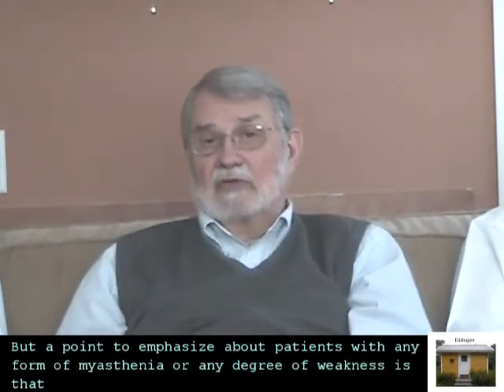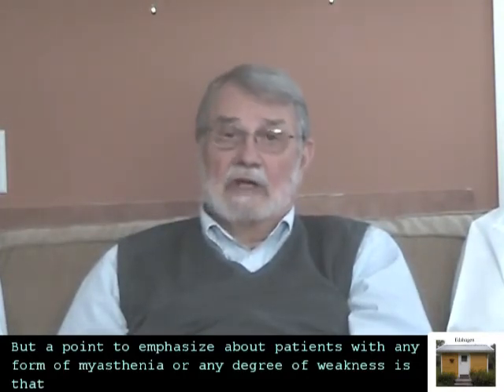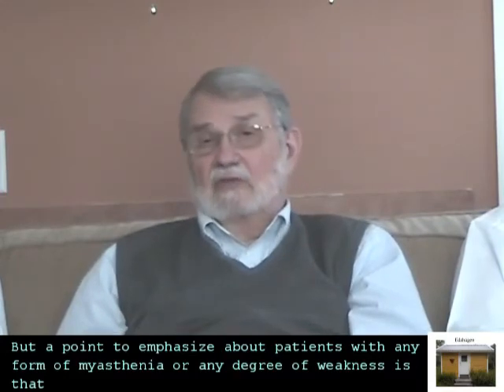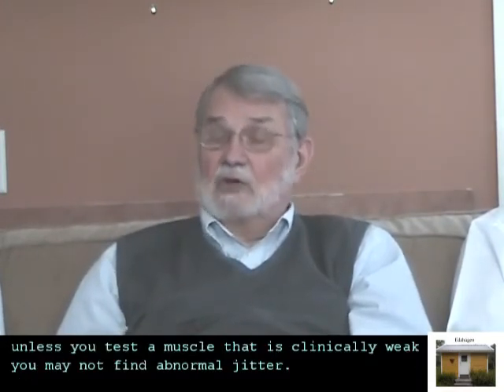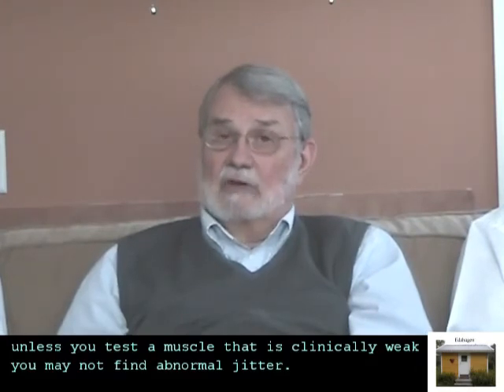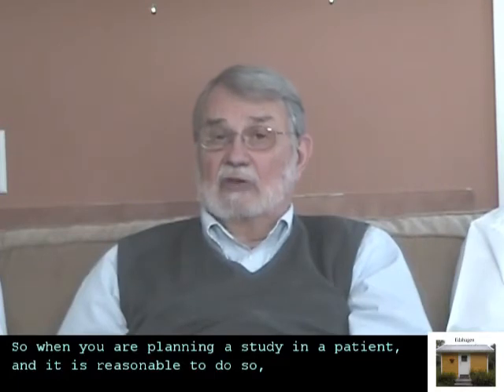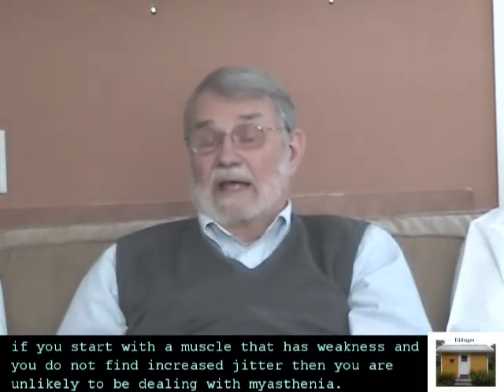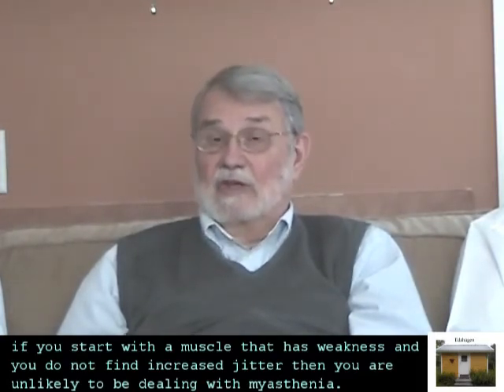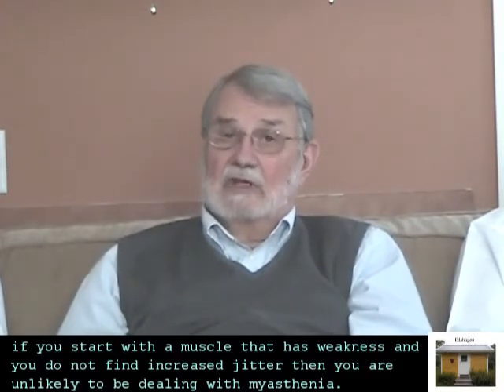But a point to emphasize about patients with any form of myasthenia or any degree of weakness is that unless you test a muscle that is clinically weak, you may not find abnormal jitter. So when you're planning a study in a patient, and it's reasonable to do so, if you start with a muscle that has weakness and you do not find increased jitter, then you're unlikely to be dealing with myasthenia.